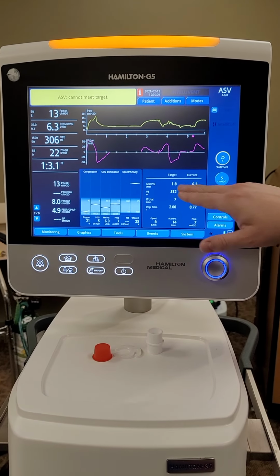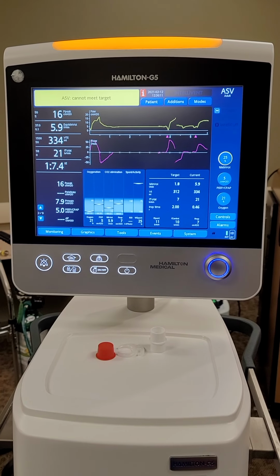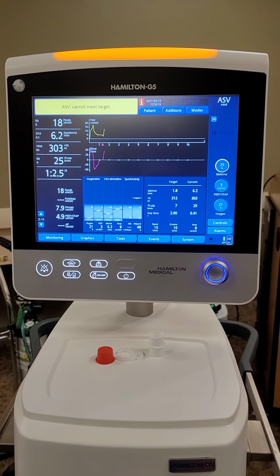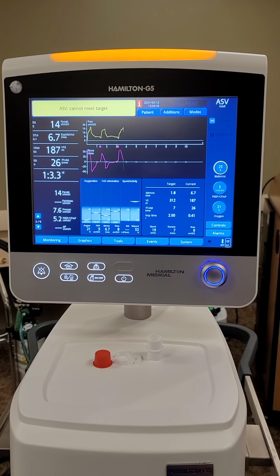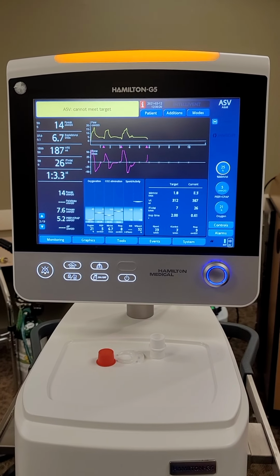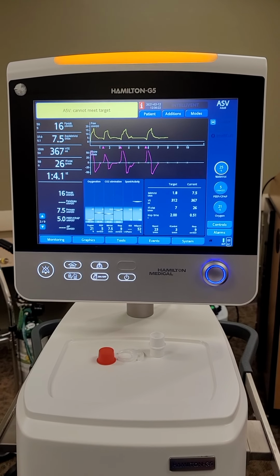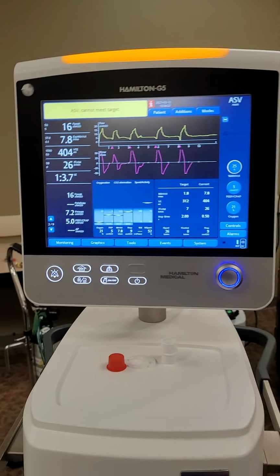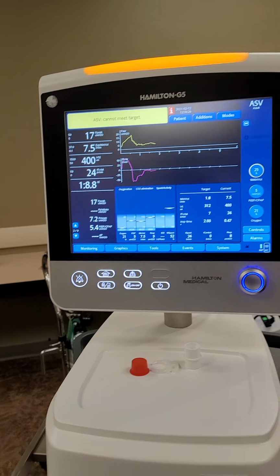Now I mean, nobody's going to let me breathe at 1.8, or if they do, you know what I mean? Like, that's death. So you just know that this is 5 over 5, what the ventilator can never reach that target. So this would put them in 100%. If you wanted to do an SBT on ASV, that's how you do it. Good. Sounds good. And if you did that for an hour, you could go back to 100%.